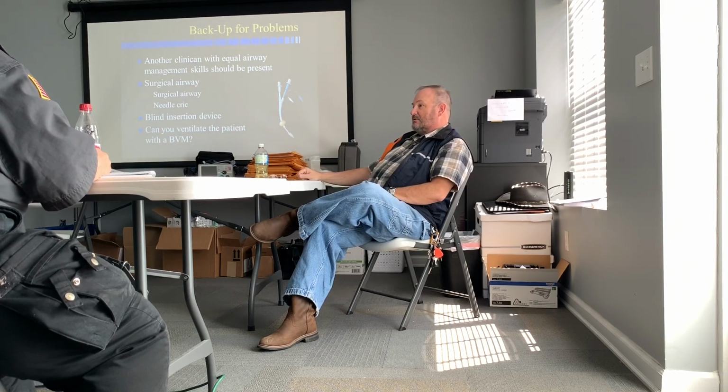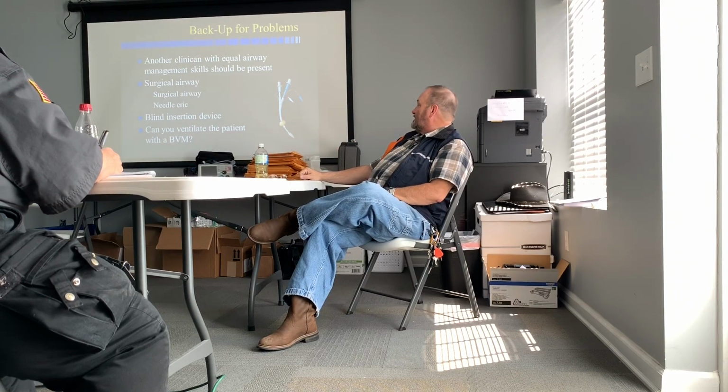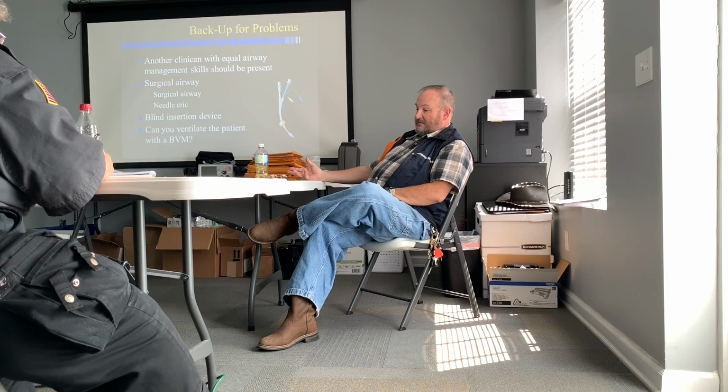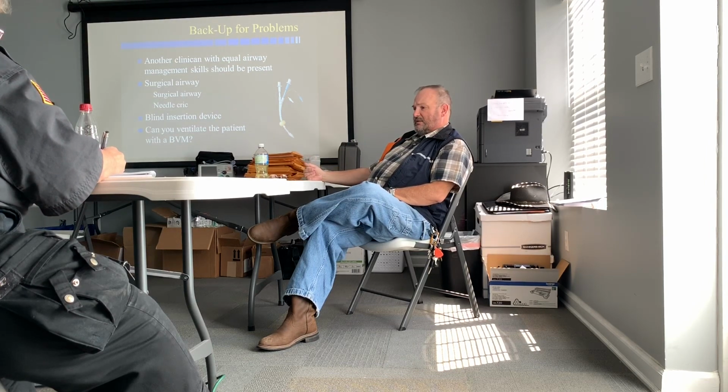And same thing here. You may very well have everybody at the station or everybody that could help, but most of the time, you guys are spread out, all going different directions with different patients, right? So, something to think about. Backup system, we ought to have a backup system. Surgical airways are very good. It's my preferred backup, but that's not always the case.